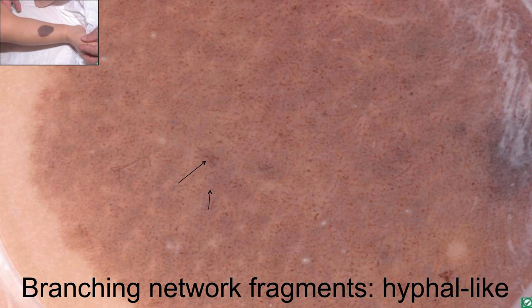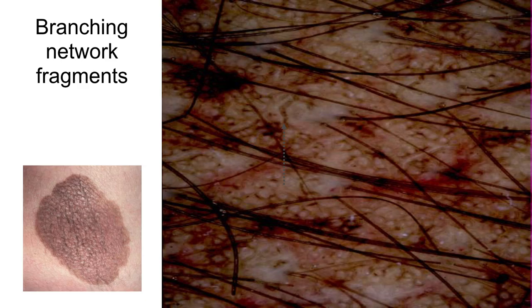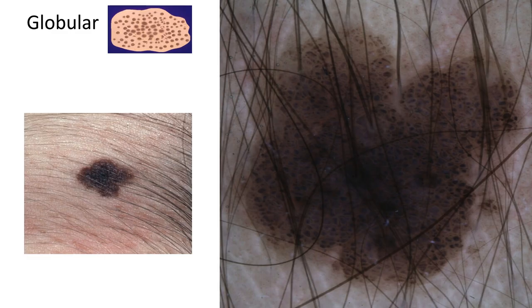A variation of the reticular pattern is the hyphal-like pattern. This is when we see branching network fragments as opposed to a well-formed network. This is also suggestive of a congenital origin. Here is another example of these branching network hyphal-like fragments.